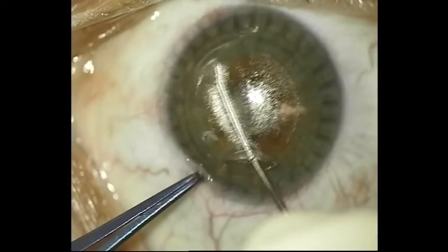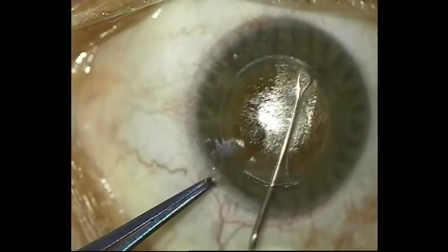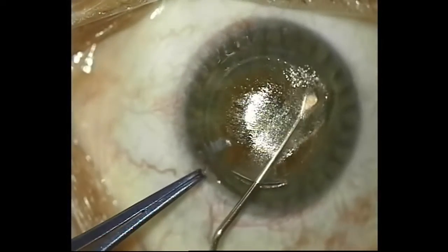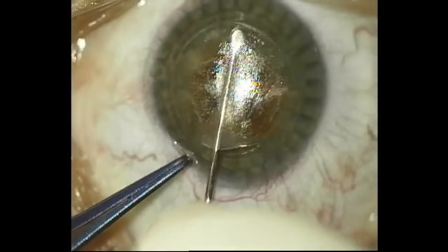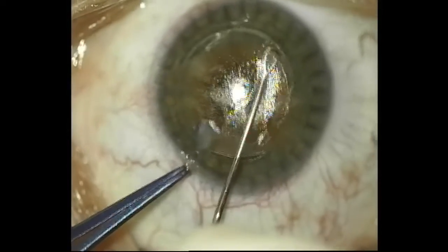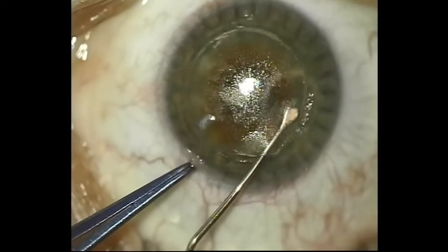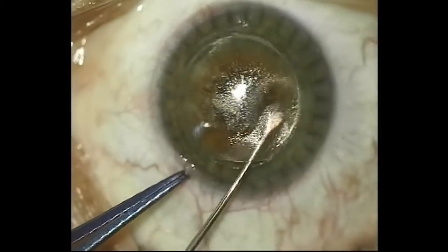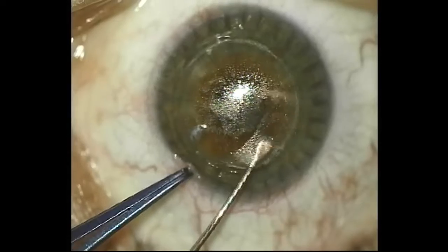This is my first eye — I'm really nervous. You probably saw me shaking earlier. But I was amazed at how efficient it was to dissect. There are some areas with a little more resistance — that's okay. Just be methodical and take your time. The anterior dissection is actually fairly straightforward; just make sure all areas are dissected.